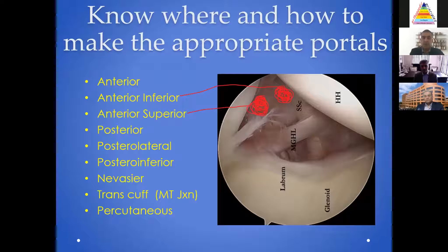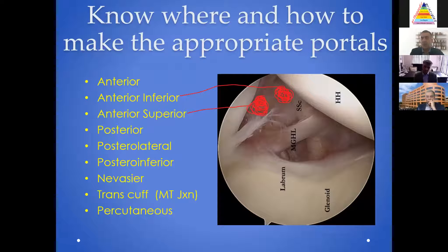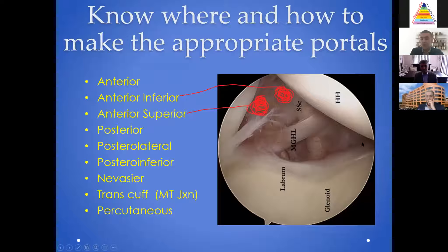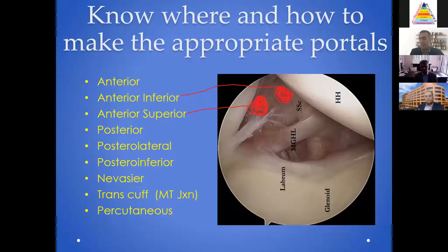Making the appropriate portals — we used to be really fixed on which portals you must make, but anterior and anterior inferior, anterior superior are my workhorse portals. One right at the level of the biceps and one at the level of the subscapularis, farther lateral in the rotator interval so you can come down and not skive. You can also use posterolateral, posterior, posterior inferior, trans-cuff, or percutaneous portals. The idea is that you want to come down and be able to address the inferior labrum and inferior glenoid comprehensively.